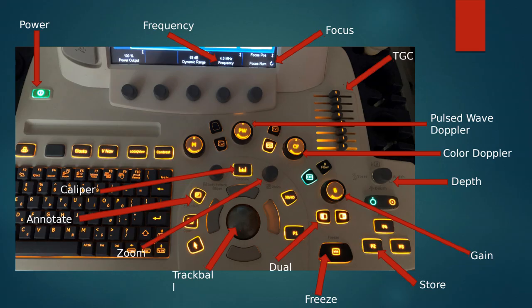And here we piece together all of the controls. So you can use this as kind of a study guide for our machine in lab. But remember, when you start clinical, some of these controls are located in different areas. Some of the multi-purpose controls are encompassing of different applications. So this is not the end-all be-all in terms of knobology placement. This is just what we have at the school. So this can help you prepare for lab a little bit better.